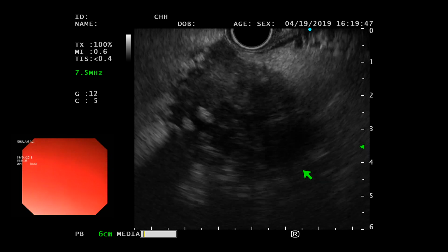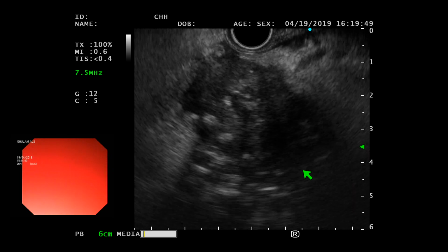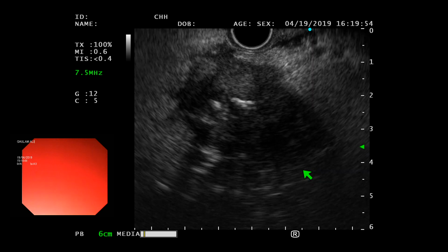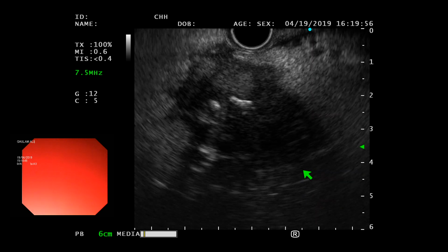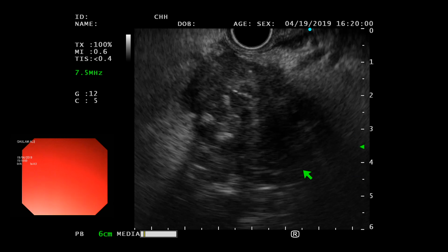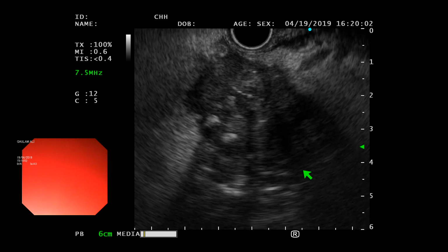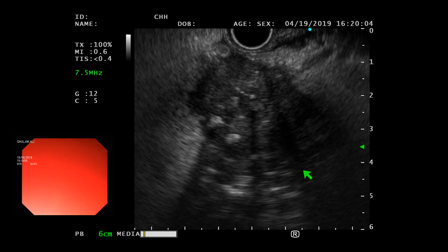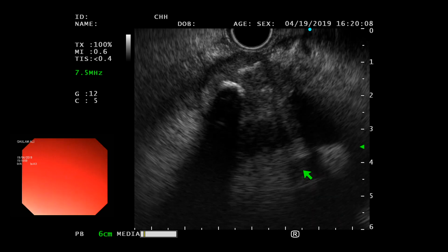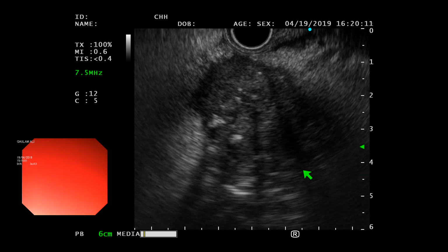If we go toward the spleen, will the pancreas still keep coming? It will keep coming as long as it is the whole pancreas. You started from the body and neck, then the distal body, then the tail. The tail of the pancreas is stuck between the spleen and the left kidney. So keep the pancreas in view, because that's your landmark.